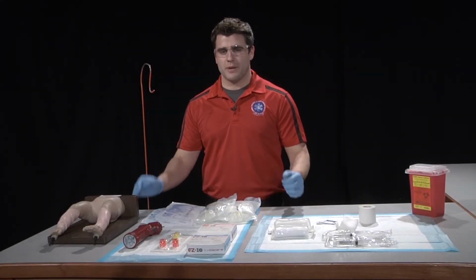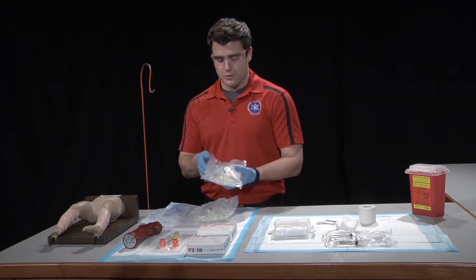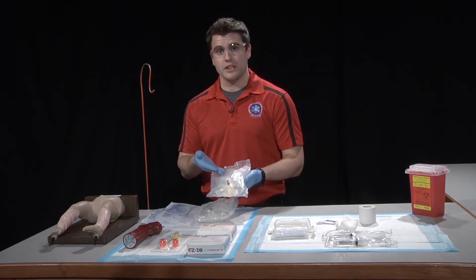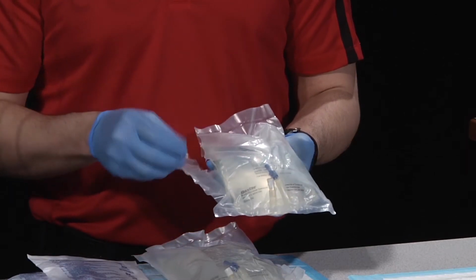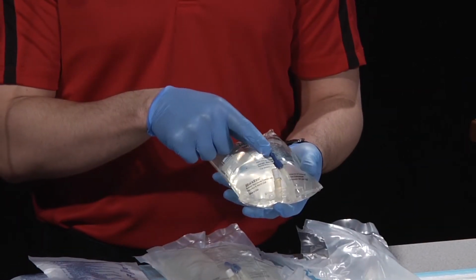Now we're going to prepare to spike the bag. First, we want to grab our saline solution and make sure we have the proper solution with a good expiration date. We also want to make sure the solution is clear and there's no particulate matter. We're also going to make sure that the tail ports still have the protective coverings on them.